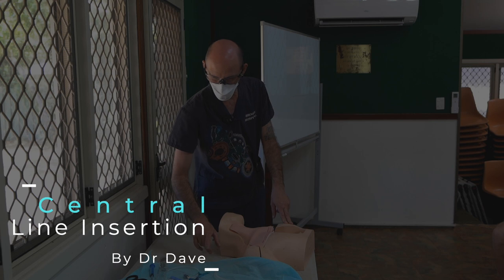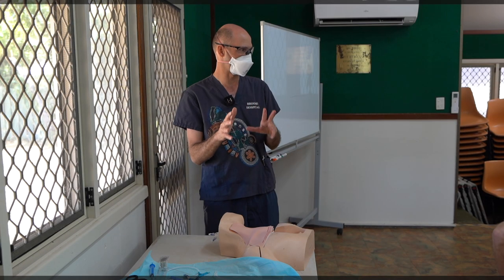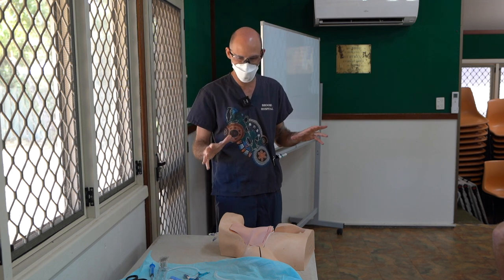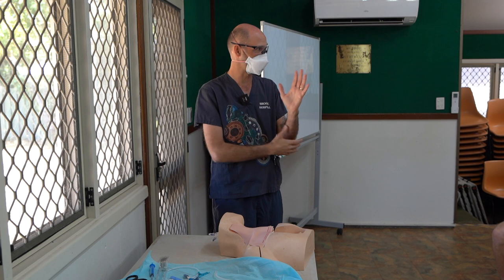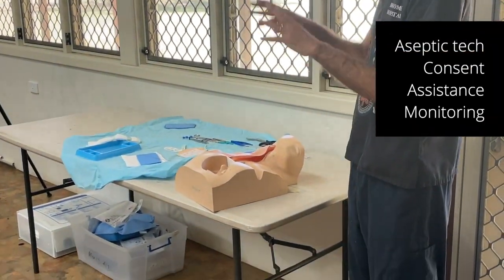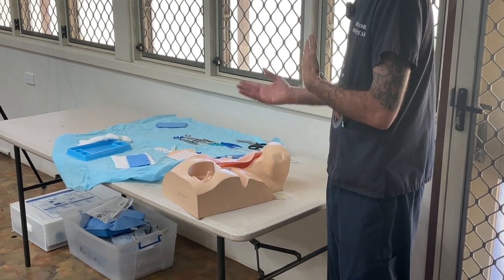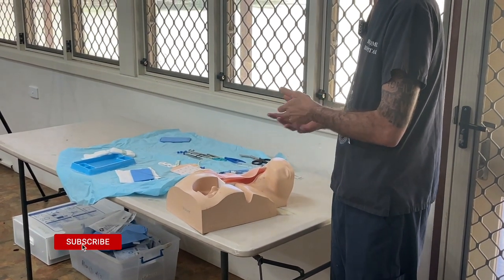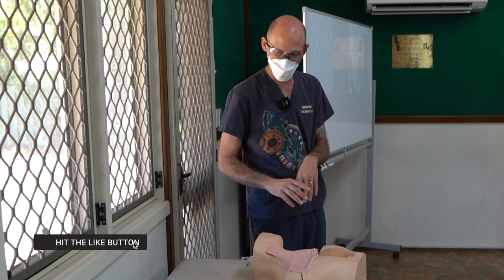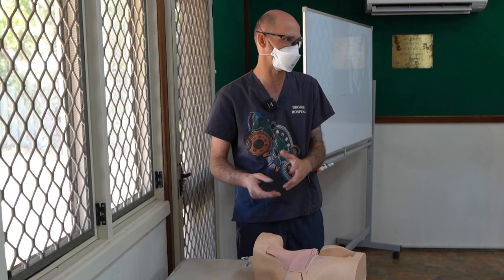Central lines first, let's put one in. I'm not going to talk about aseptic technique today — I am clean, using aseptic technique, scrubbed bare below the elbows. The patient, if they can, before these procedures — you've explained the problem, you've consented them, talked about different options, and they've agreed and signed. I'm presuming this is all set up in a sterile fashion and I've got help if I need it.